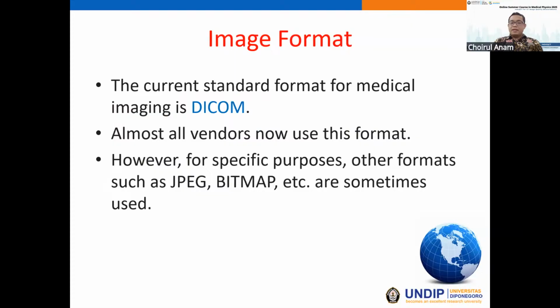The current standard format for medical imaging is DICOM. For all modalities, for the CT, the DR, the CR, the mammography, the USG, all use the DICOM format.